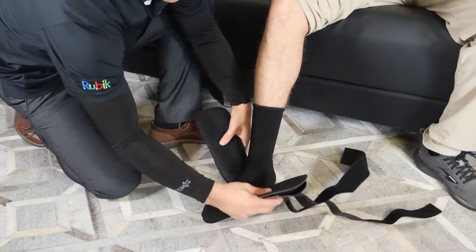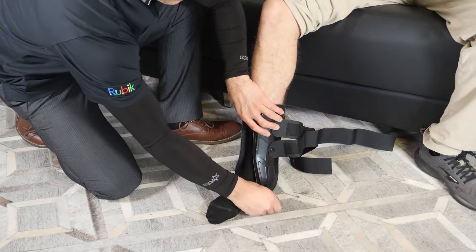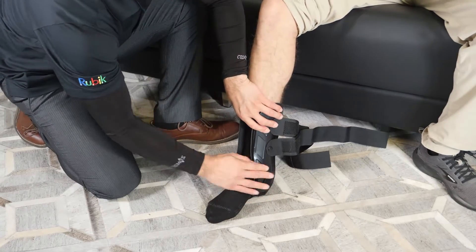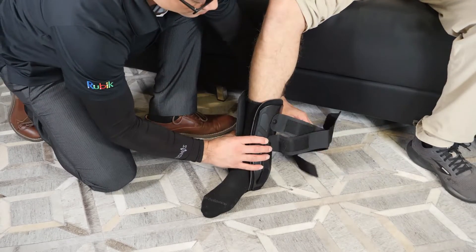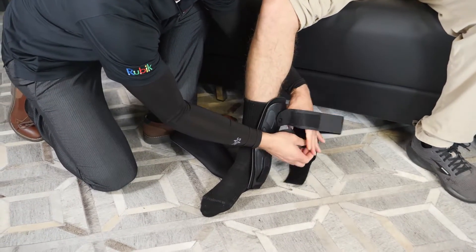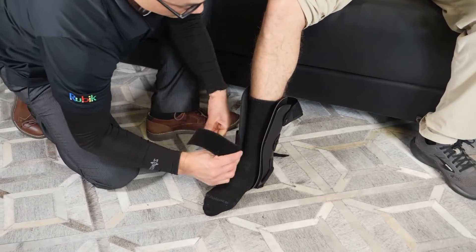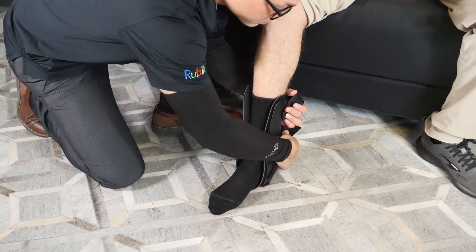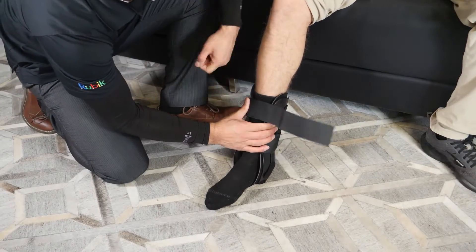First, adjust the velcro straps so the brace can fit over the ankle and the foot. Attach the straps from one side of the brace to the other side of the velcro. Apply the brace nice and snug so the brace doesn't slip away from the foot or the ankle while the patient is walking.